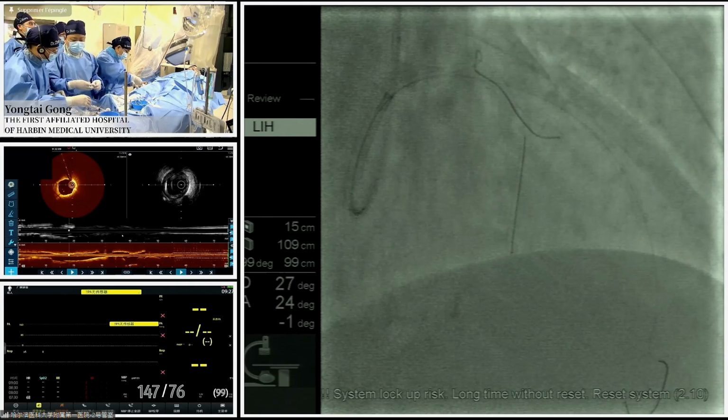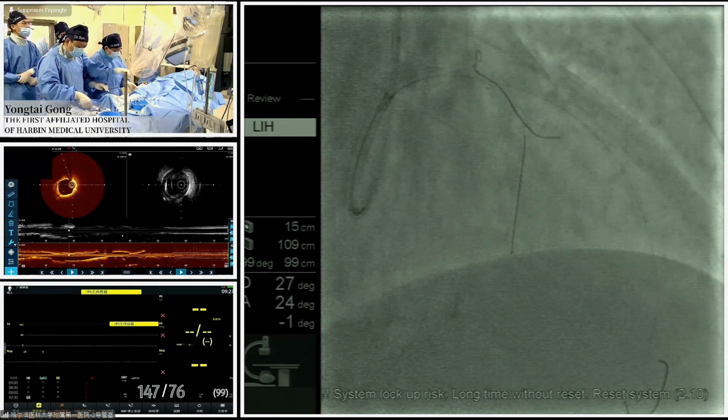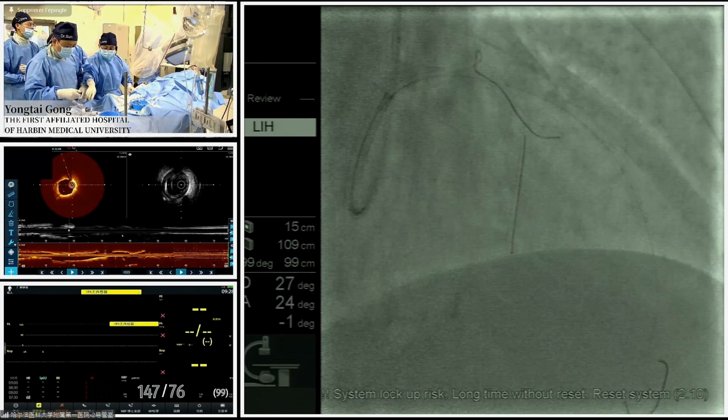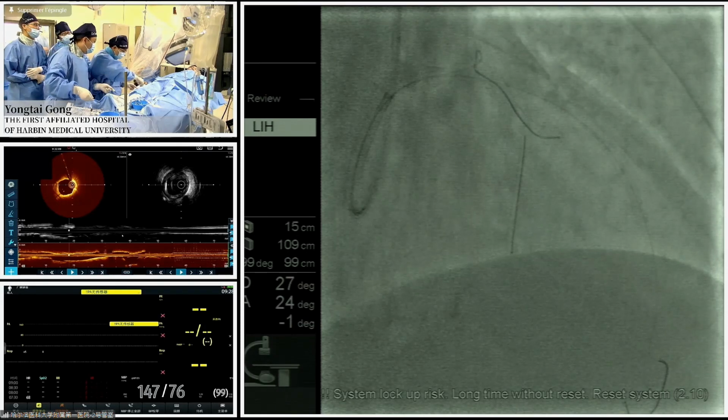The first one is, as we know, we have to choose the stent size and identify the stent landing zones. Commonly, due to an ostial lesion or a proximal stent location with a larger side branch entry, we often cannot accurately identify the proximal reference lumen diameter. So in our hospital, we usually depend on the distal reference external elastic membrane to choose a closely downsized stent.